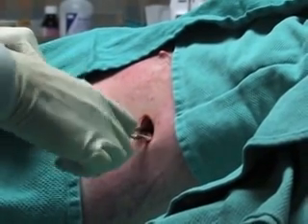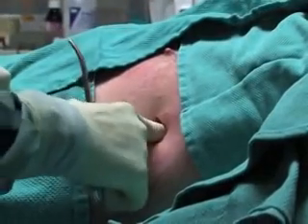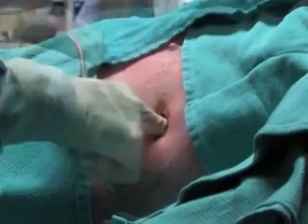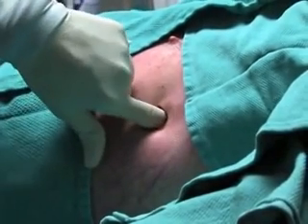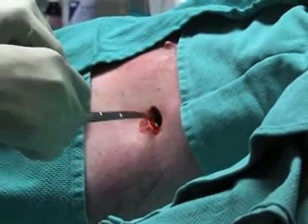When using a larger chest tube of size 24 French or greater, use your index finger to explore the tract being created by blunt dissection. This is done to ensure the larger caliber tube will be able to pass through the tract. Once you have dissected through the subcutaneous tissues and deeper intercostal muscle layers, you will encounter the parietal pleura.